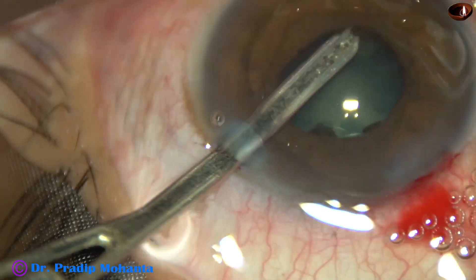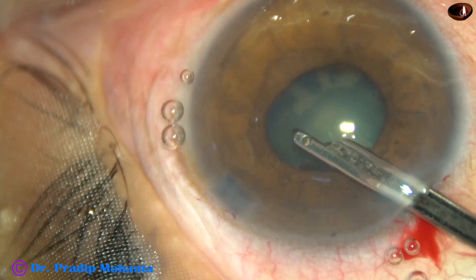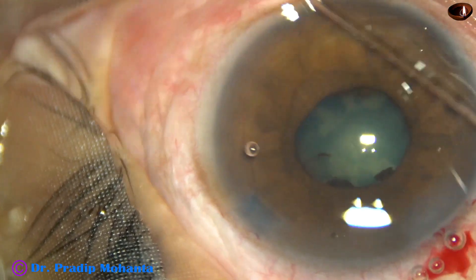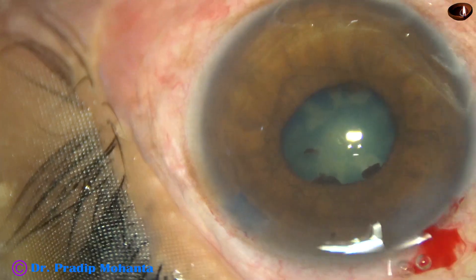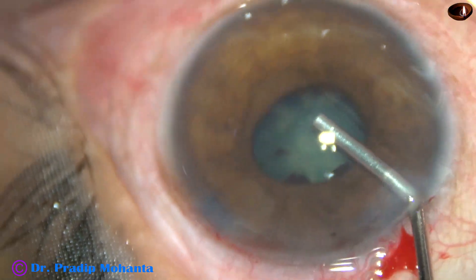By the Simcoe cannula itself, the posterior synechia have been broken. Otherwise, we can use an iris spatula for this purpose. Now viscoelastic is injected into the anterior chamber.